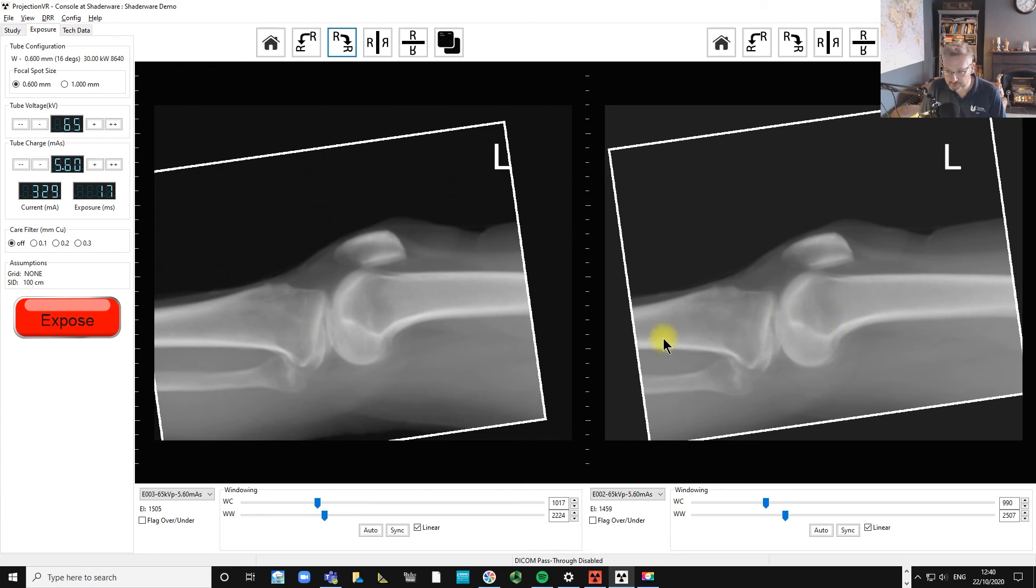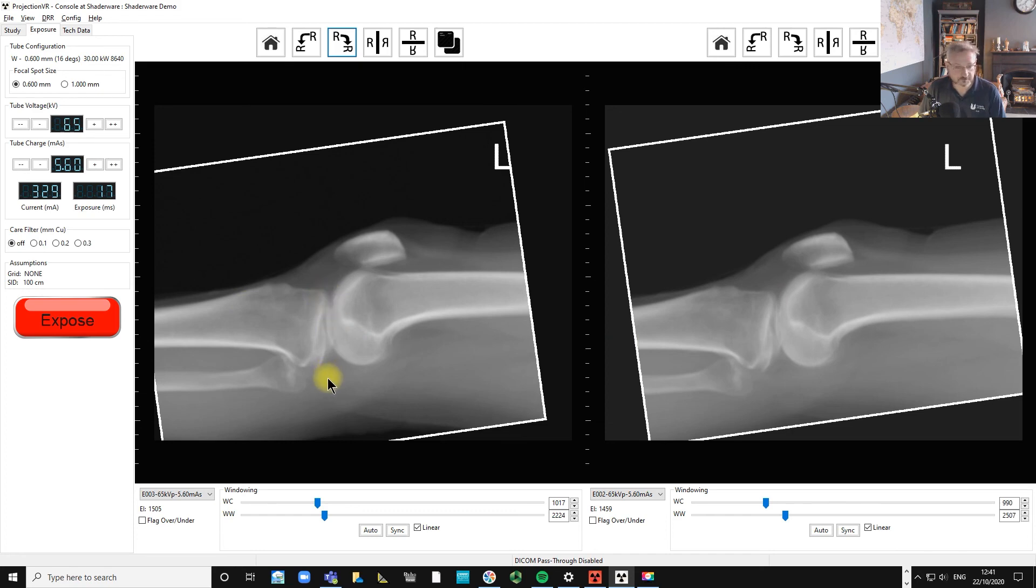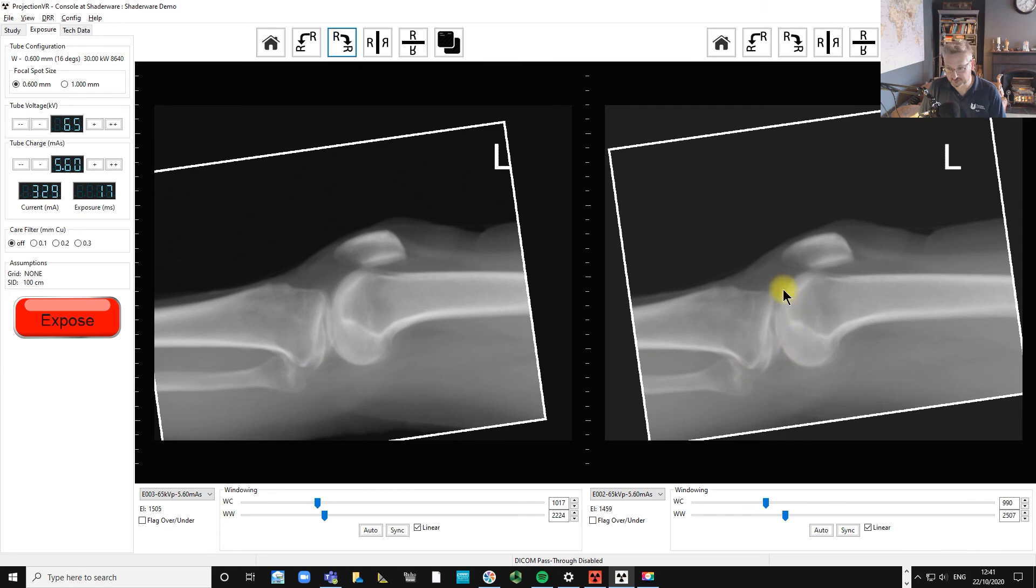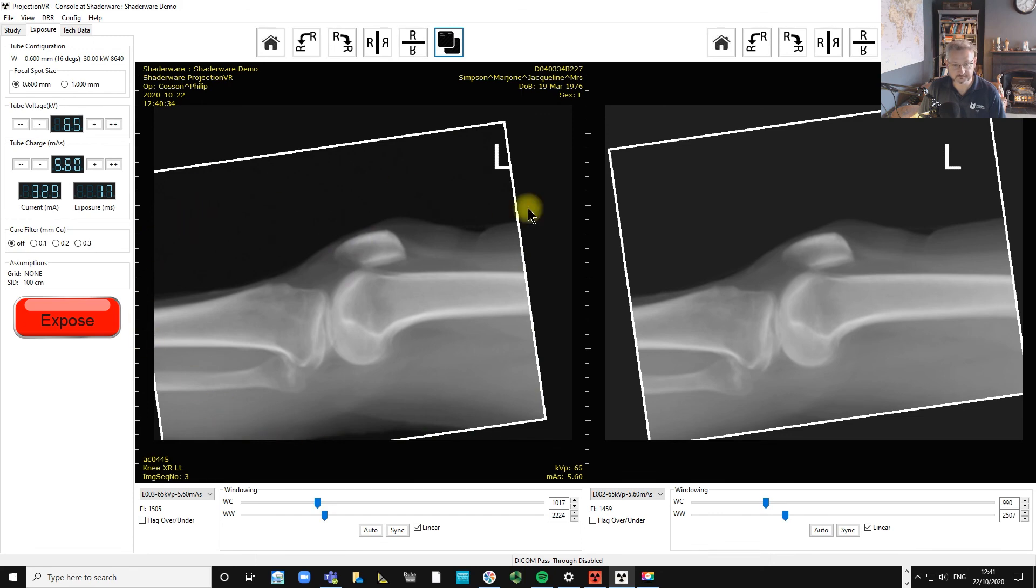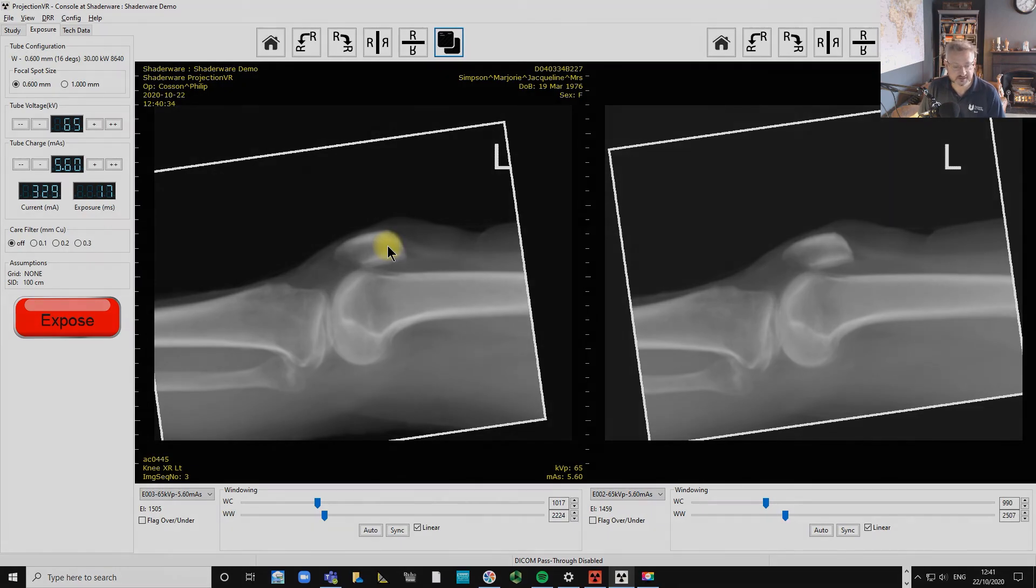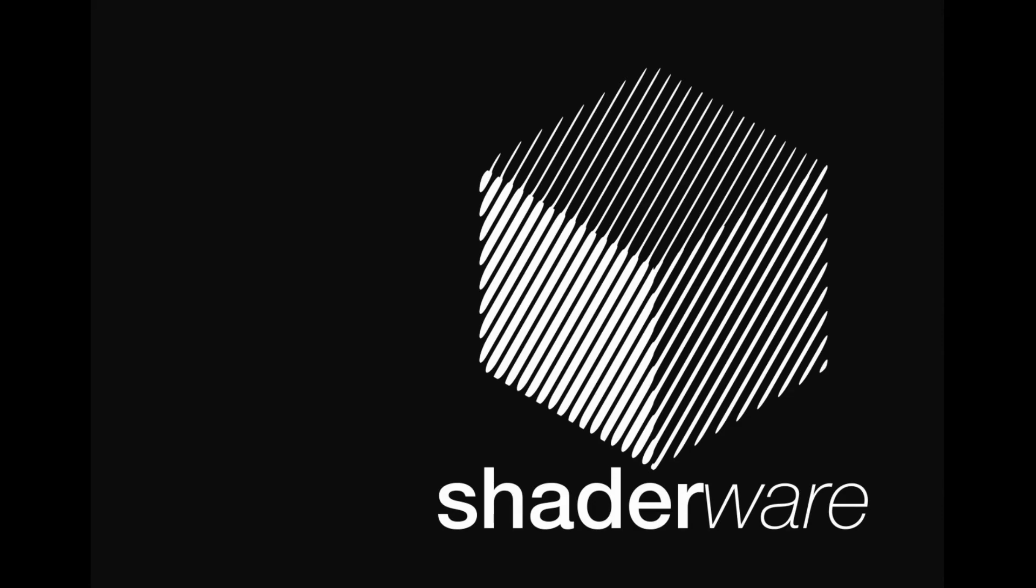It hasn't really made a lot of difference. I think the condyles of the tibia are now more superimposed than they were, but only very, very slightly. So I couldn't claim that there's a huge improvement in the projection given one inch difference in centering, which just goes to prove that one shouldn't be too worried about centering points as long as you've got all of the anatomy on. The centering point can be a bit more flexible than maybe the books explain it to be.